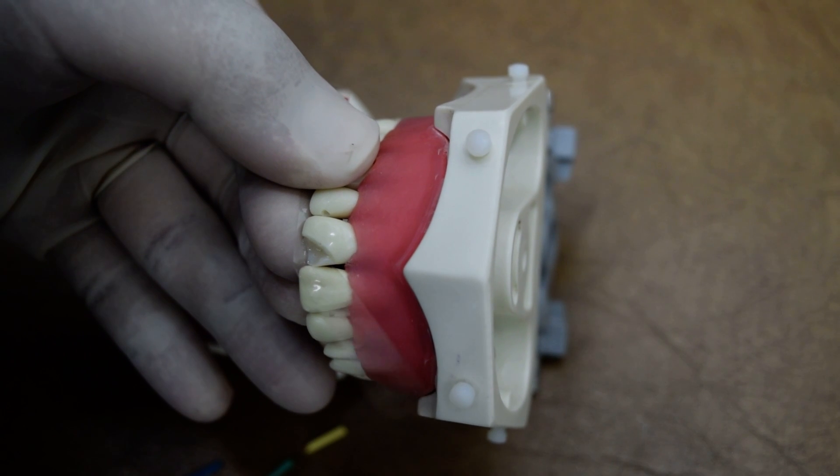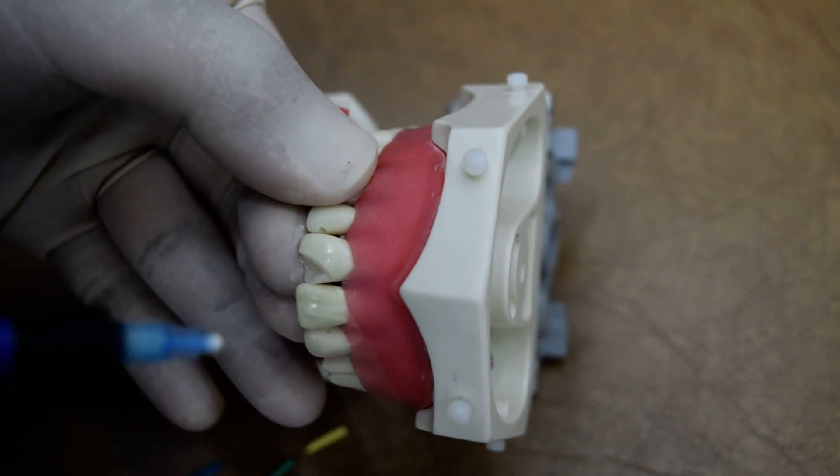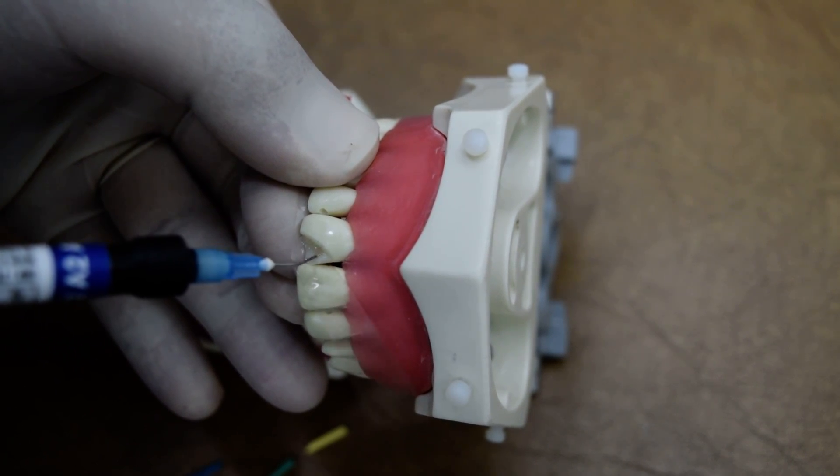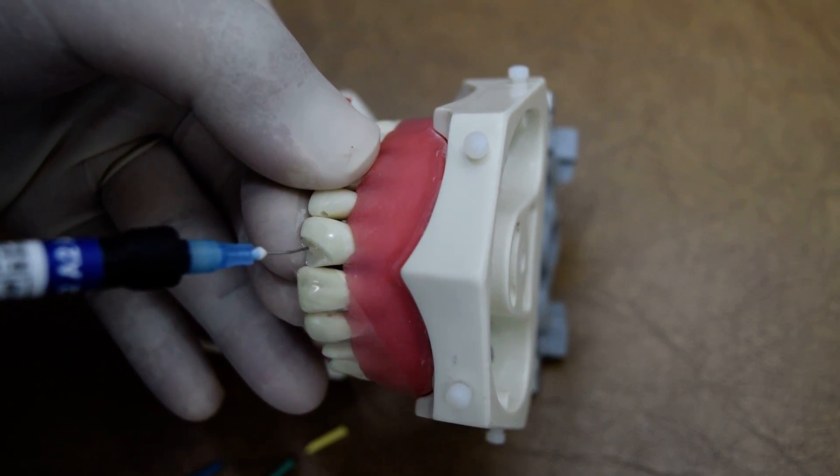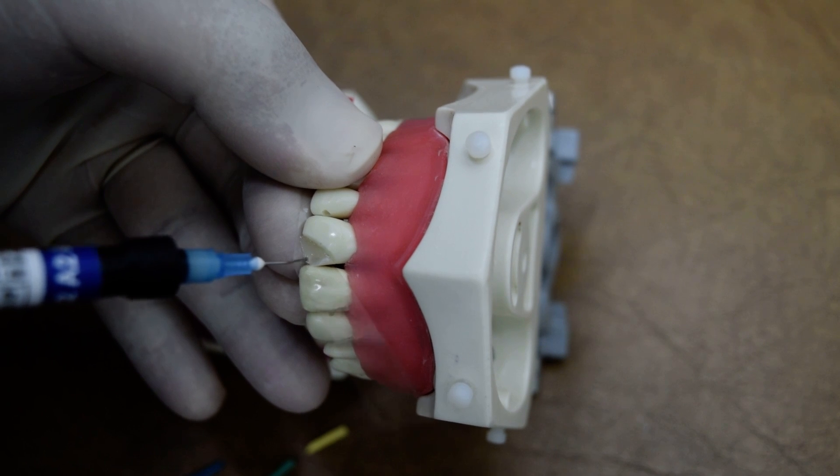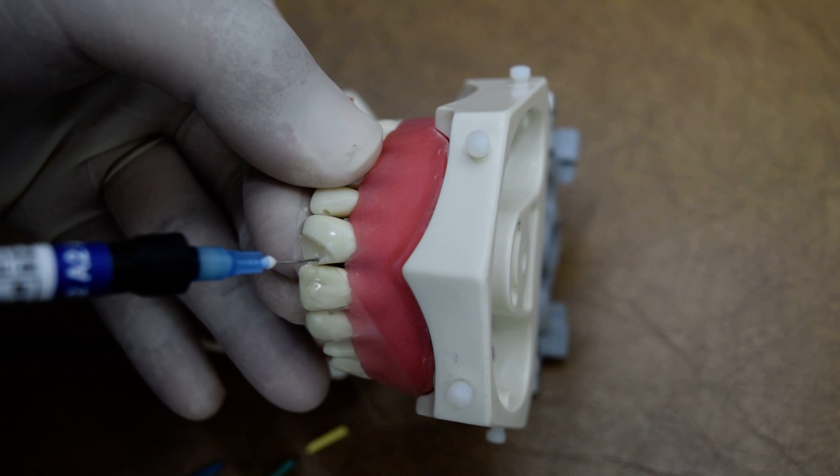As we are going to use flowable, we cannot close the strip over the tooth because it will lead to uncontrollable excess. So it's better to leave it open.